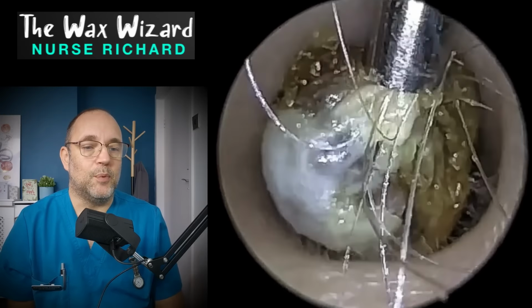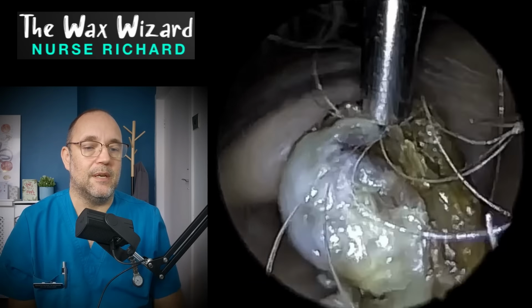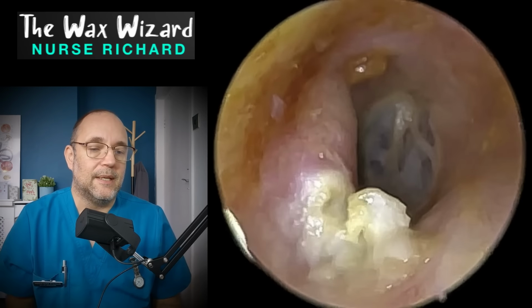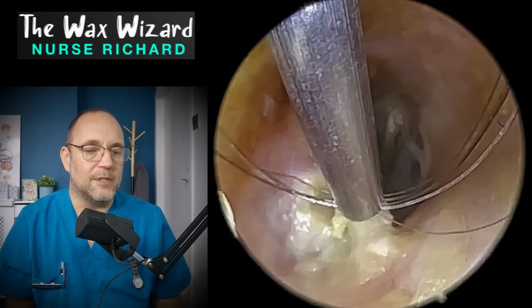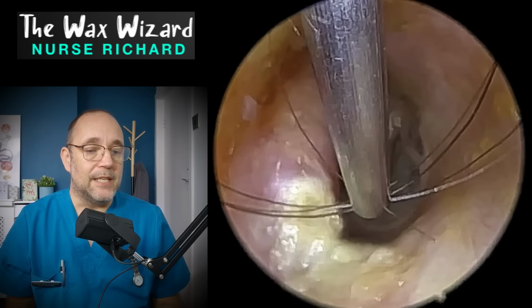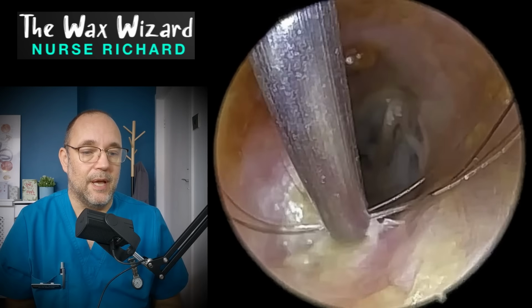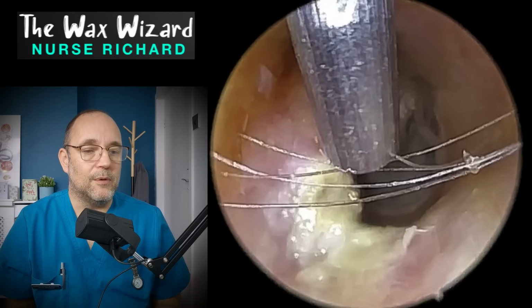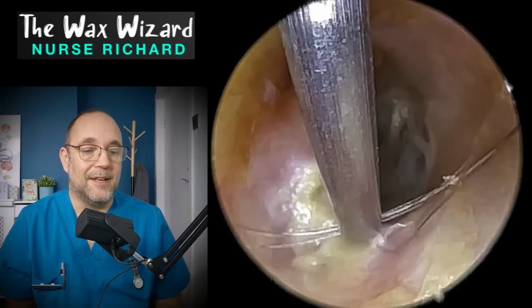And so as you can see, pull this out there and there's a giant plug of skin. Underneath it, you can see some of this mushy white stuff, which is freshly shed skin, so there's an indication that there's been a bit of discharge, and you can see why that was here, because you've got this little area here which is slightly concerning. You're wondering where those hairs are coming from. They actually are from her head.